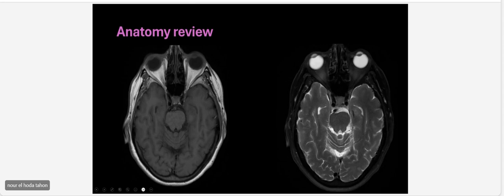And again, make sure to see the sulci, you can see the fluid is very nice here. Sometimes if you have a mass effect, all of these sulci are effaced. So you cannot see the nice picture of this fluid here. Sometimes maybe you don't have an enhancing mass, you just have the mass effect and the effacement of the sulci, effacement of the ventricle. I mean, effacement like compression on something. So it's effaced like closed. When you see this, you suspect a mass. Even if you don't have enhancement, you don't have anything to give a clue, just the mass effect and the effacement. That's why I keep emphasizing this, you have to look for it.